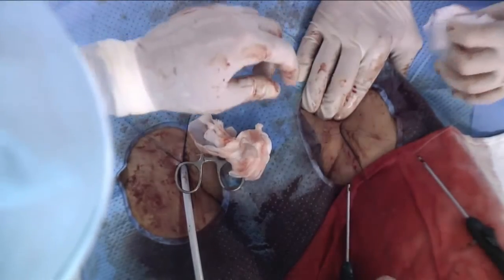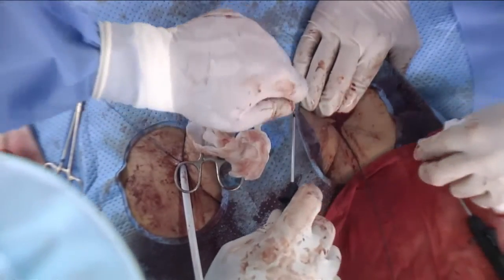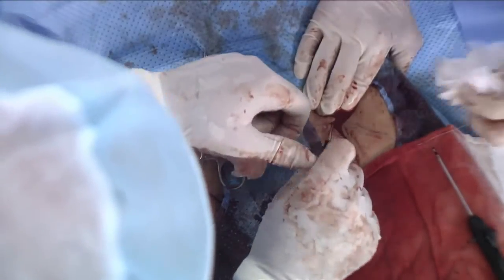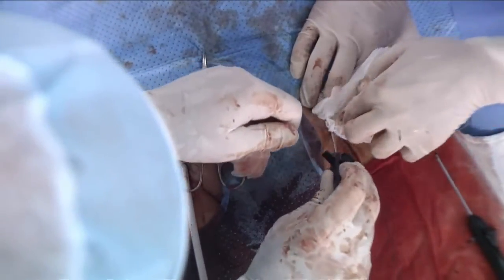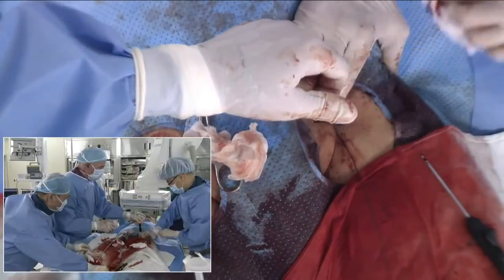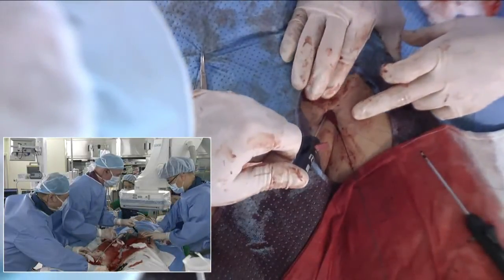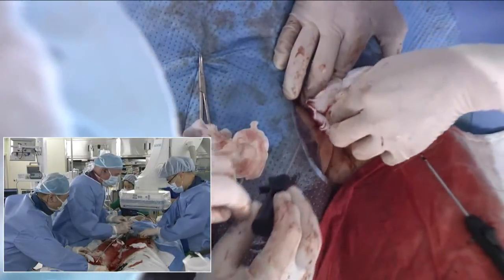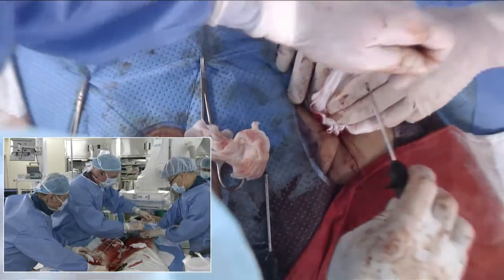So now we'll slide down the second knot. Okay, why don't you let up for a second? I don't think we've gotten down to the artery clearly. Okay, that's better. Why don't you let up, Dr. Park? Let up. Okay. So we'll go ahead and go back down with the first knot.